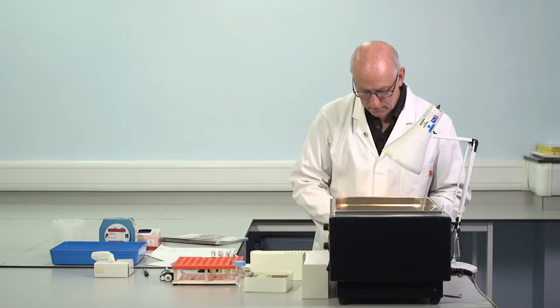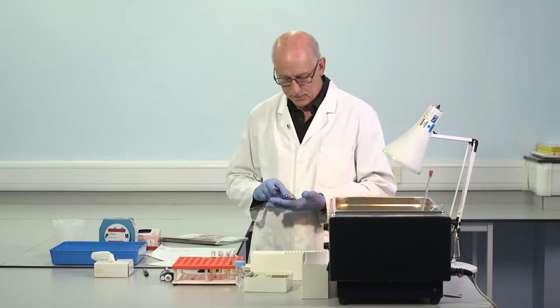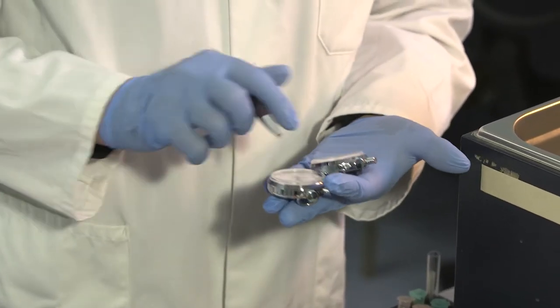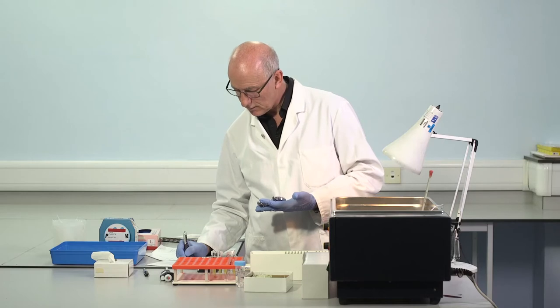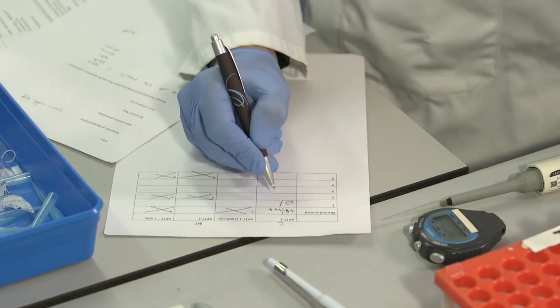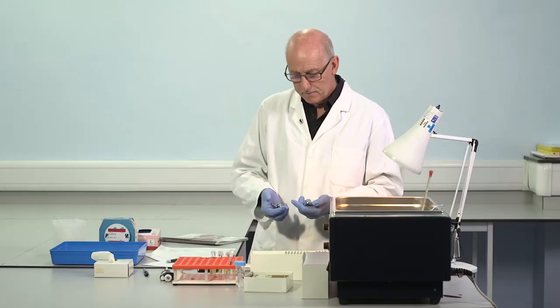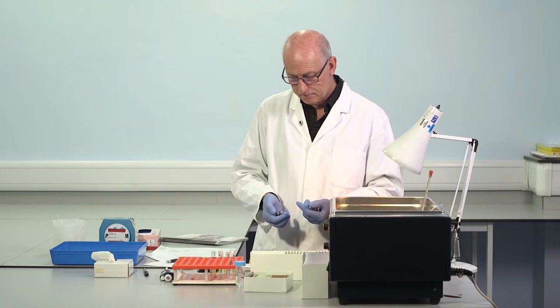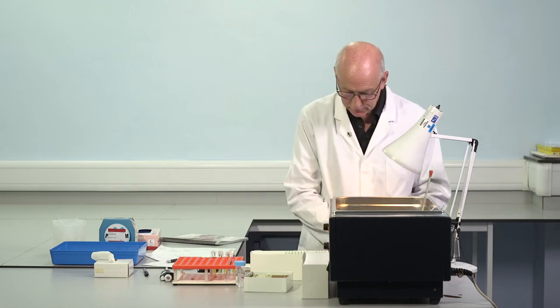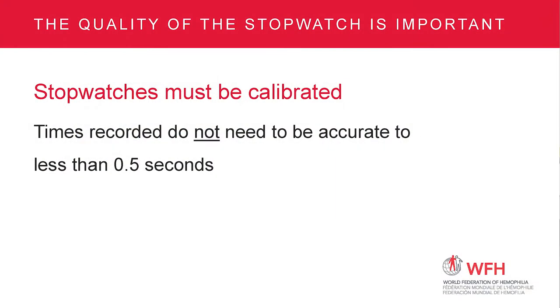Now, we need to record the clotting times. Remember, this is the first patient sample. So the first clotting time is 47 seconds. The second clotting time is 48 seconds. So we'll take an average. Okay, so just zero those. Fresh tip. Okay, we'll start an APTT on the second patient and then we'll make some comments on reference range.